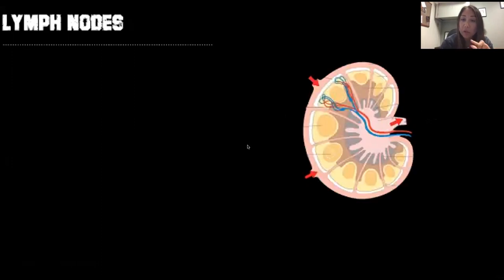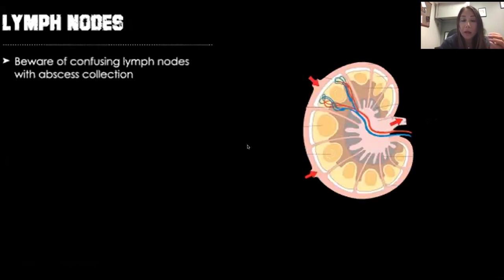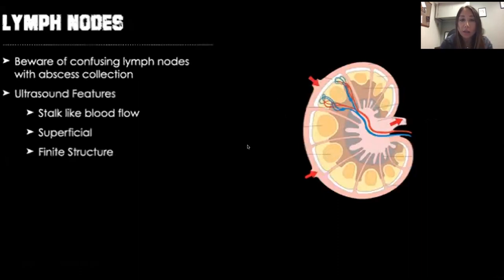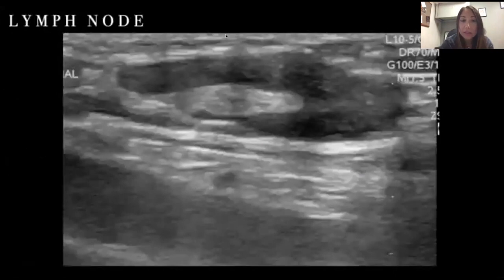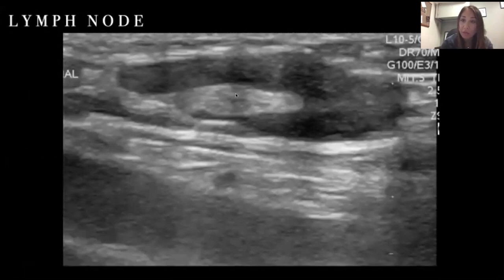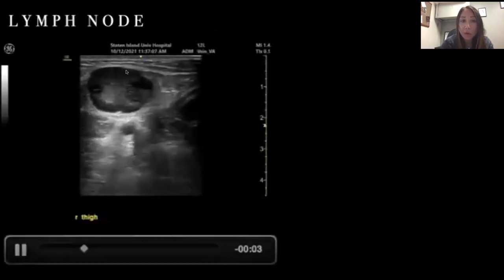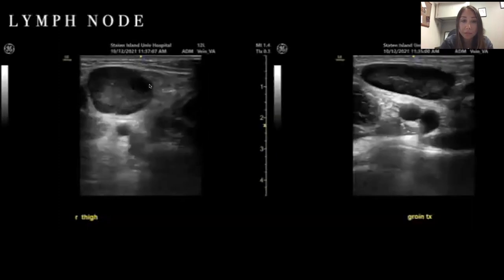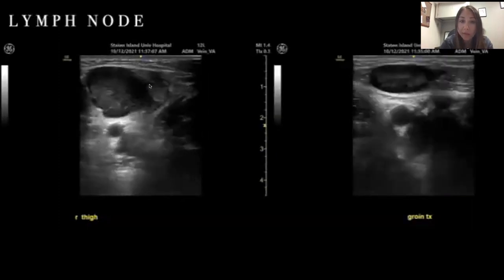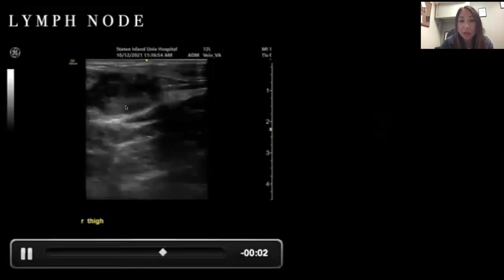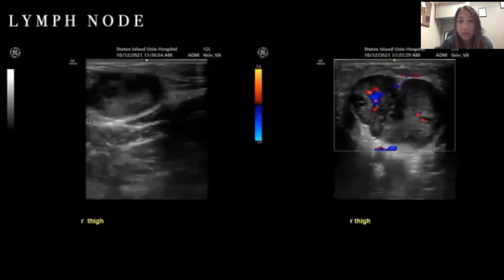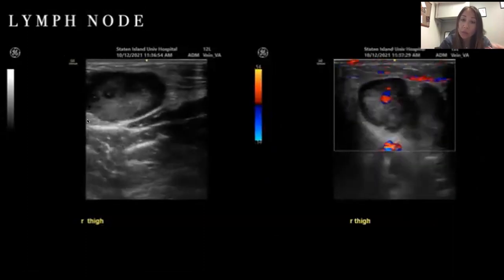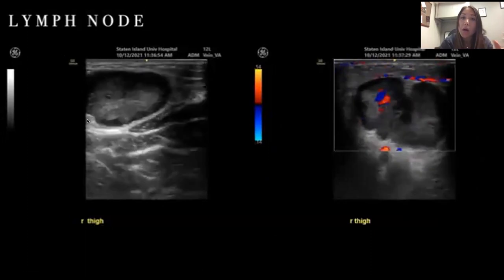Lymph nodes should be distinguished from abscess formation. Unlike abscesses, lymph nodes have a stalk-like blood flow appearance — they're superficial and have a finite structure. You can see a hypoechoic region with a hyperechoic middle, which is the hilum stalk. You can scan through them and see the stalk in the middle. You can put color flow on lymph nodes at the hilum and you'll see increased color flow as well.